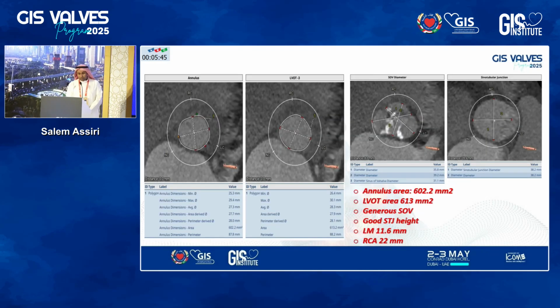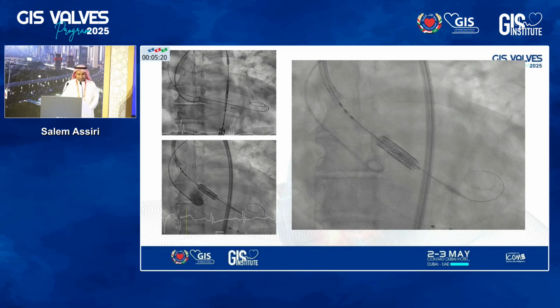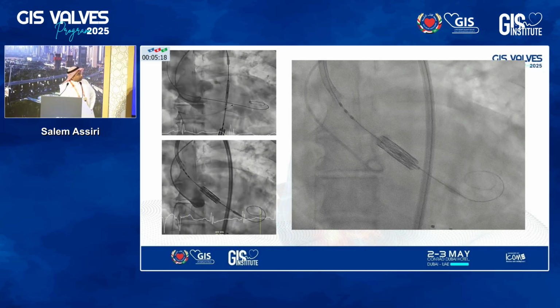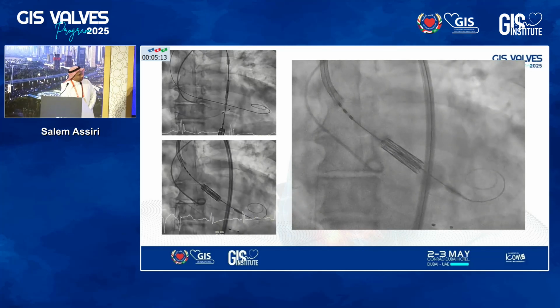This is his CT. You can see the measurements are actually pretty good. The annulus area above 600, the LVOT, not much of a calcium. I didn't actually show that, but it wasn't a calcium. Generous SOV, we're talking about 38, 39, and also good STJ height. The left main is relatively low, but the SOV is actually generous. RCA height is 22 millimeter. So straightforward, basically, TAVR.